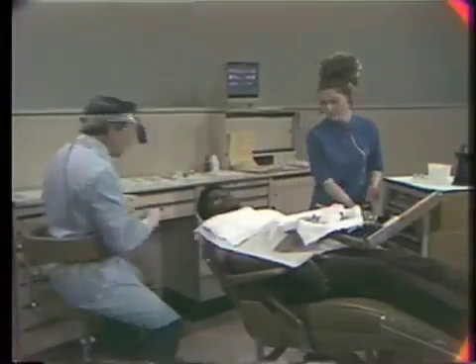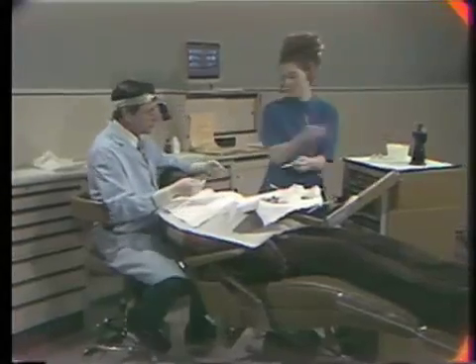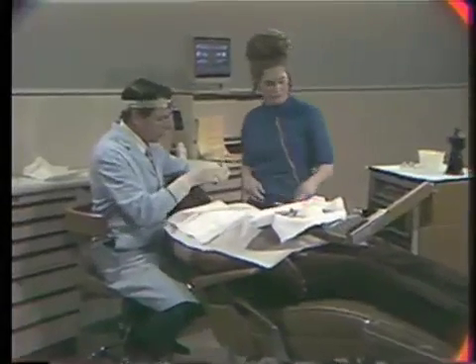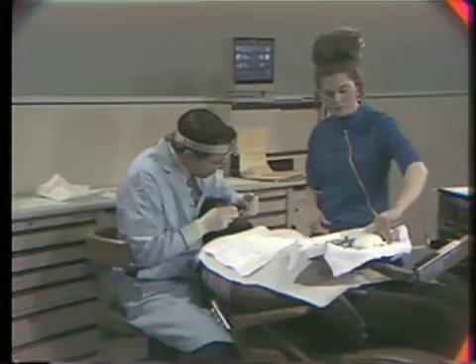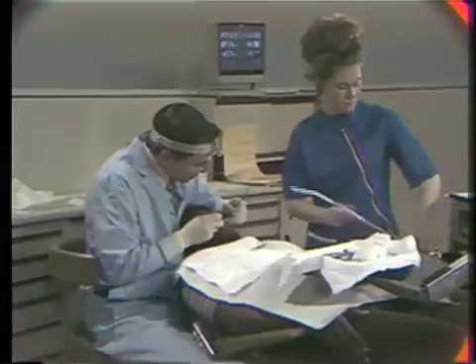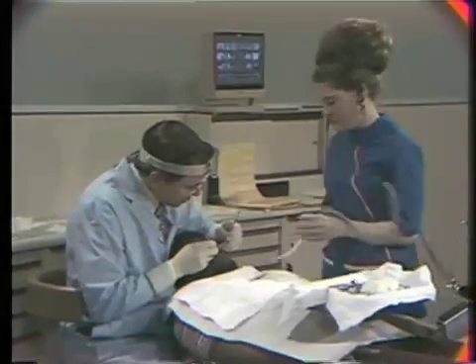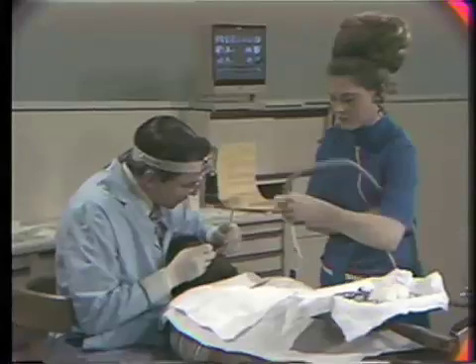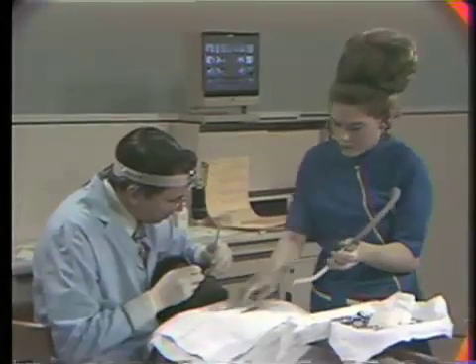She'll first hand the Explorer and the mirror, and she warmed the mirror on the alcohol torch over there so that it's warm and doesn't fog up when it enters the mouth. And you can see how she's removing the equipment and getting things ready to go as I'm examining the mouth prior to administration of the anesthetic.